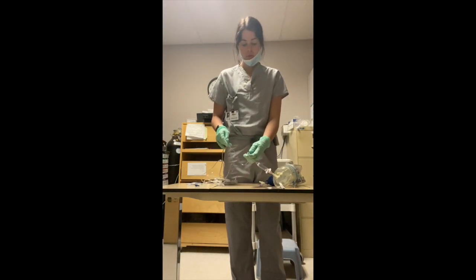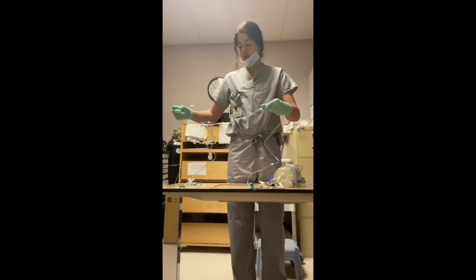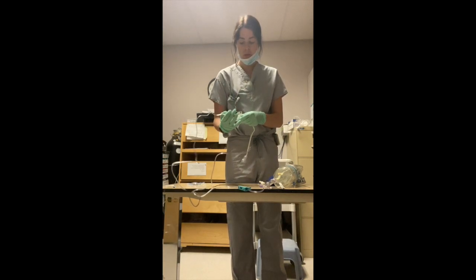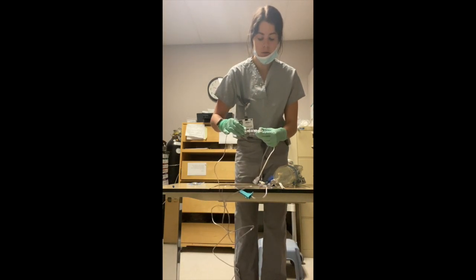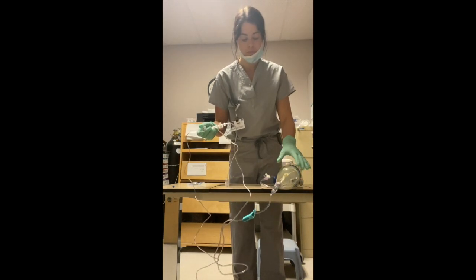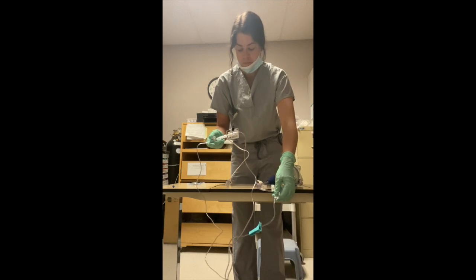Next up, we have our roller clamp that comes down to the first line that we're going to prime. So we switch the stopcock off. You may have to squeeze it a couple of times to get the water to fill.